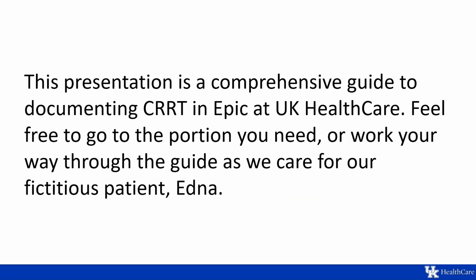The intention of this presentation is to be a comprehensive guide for documenting CRRT. It's basically the worst day that you could ever possibly have with a patient on CRRT, where you would encounter a multitude of situations that you'd have to document. Hopefully you will never in your career have to do all of these things in one day on one patient, but if you do, we got you covered.